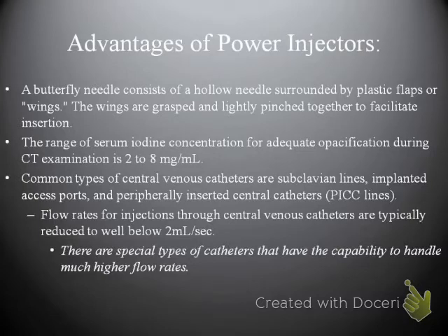The typical rule of thumb, when you're dealing with central lines, PICC lines, things like this, is to find out as much as you can about the catheter, and then check with the attending physician or the radiologist to see whether they even want you to utilize it, because many times exams get ordered without thought being given to what the patient actually has for intravenous access.